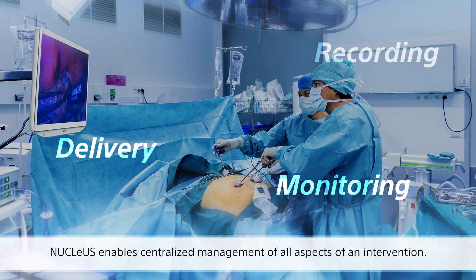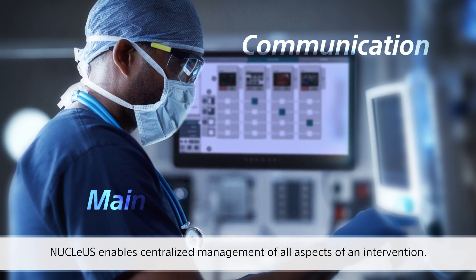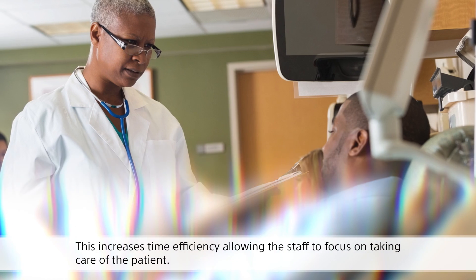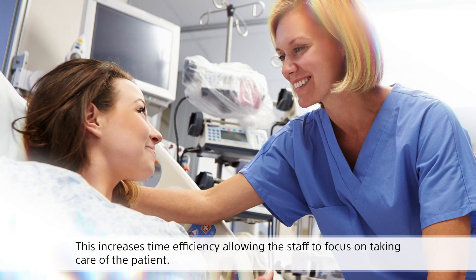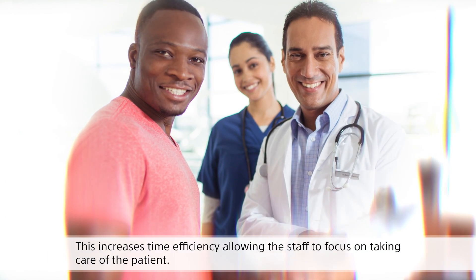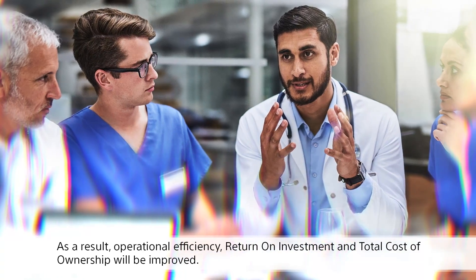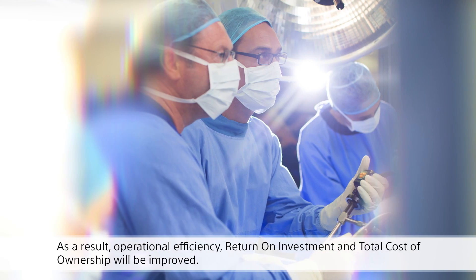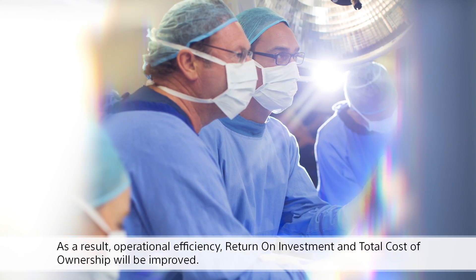Nucleus enables centralized management of all aspects of an intervention. This increases time efficiency, allowing the staff to focus on taking care of the patient. As a result, operational efficiency, return on investment, and total cost of ownership will be improved.